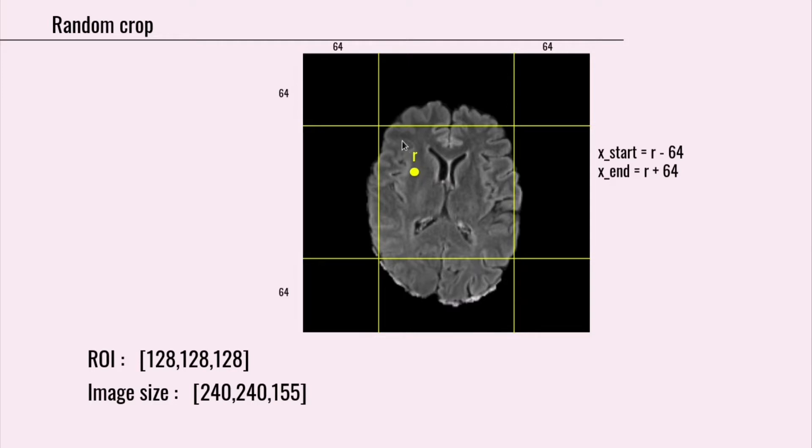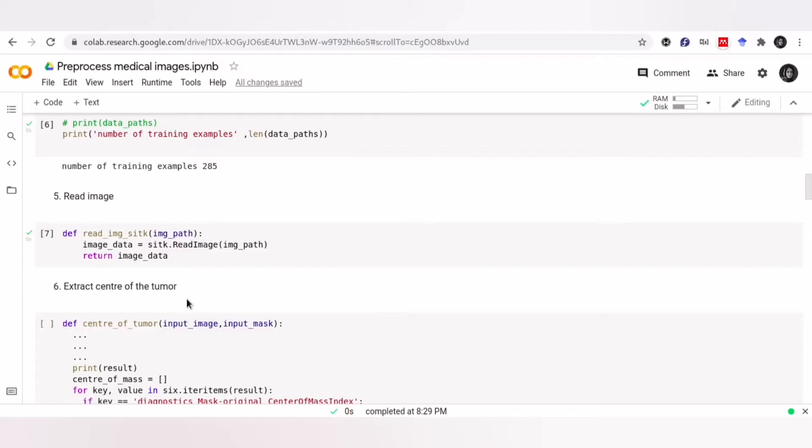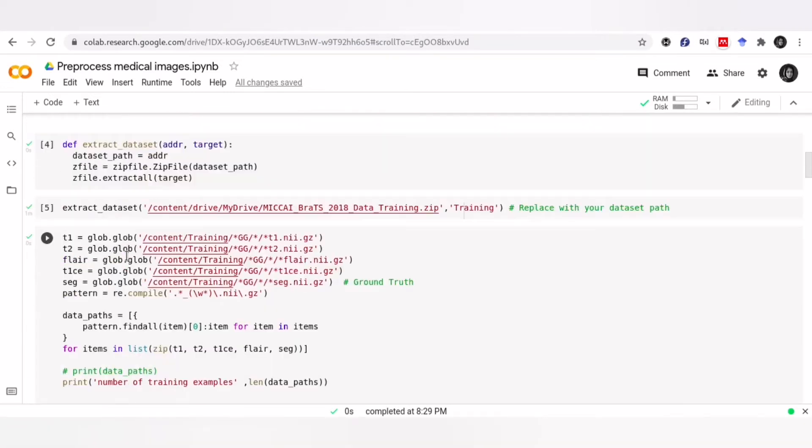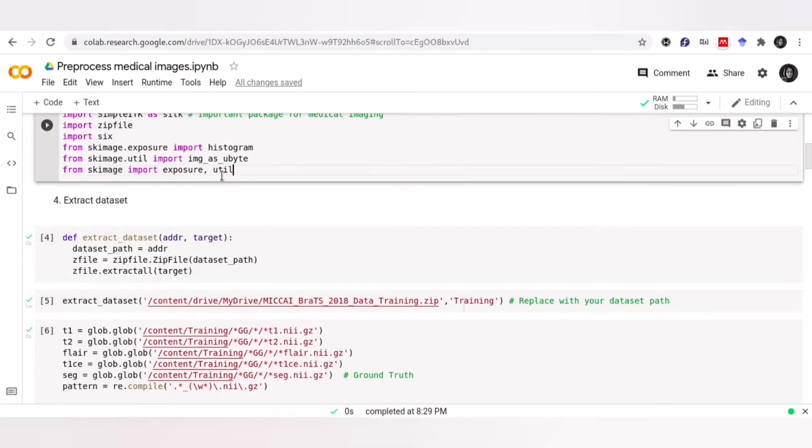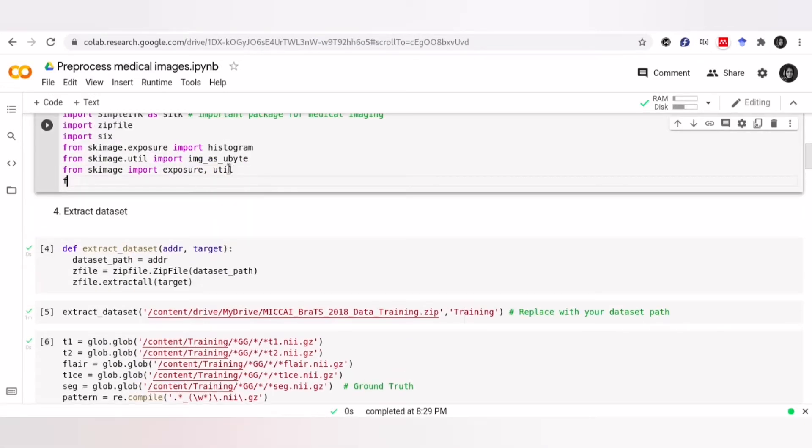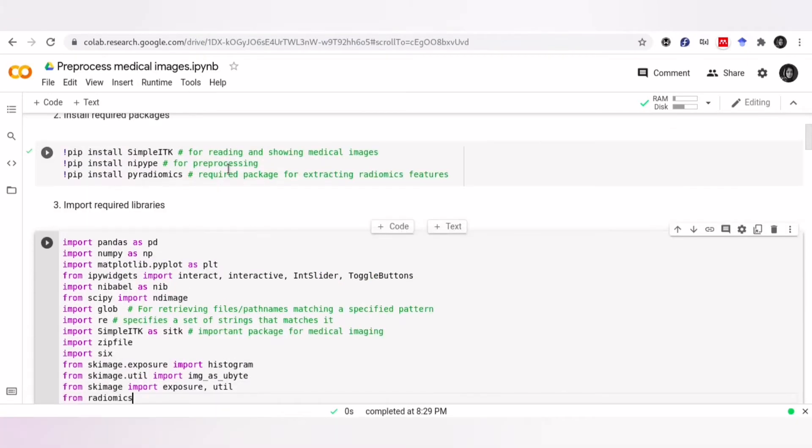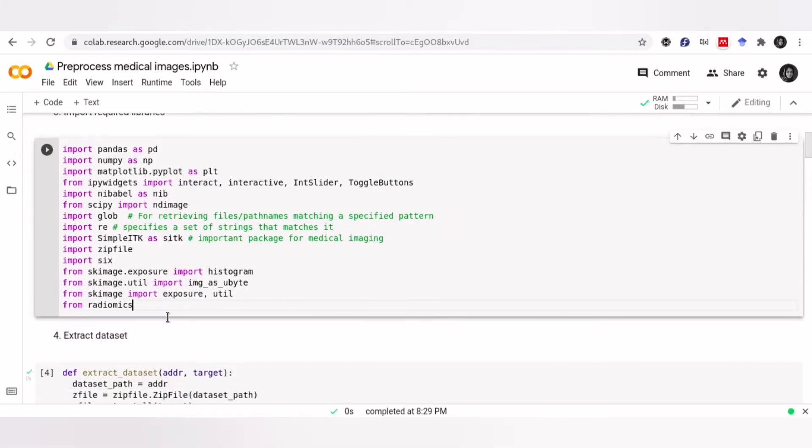There is a very useful library called PyRadiomics, which helps you to extract radiomics features. I use this library to extract the center of tumor. As you can see, I have installed it here, and now I import feature extractor.